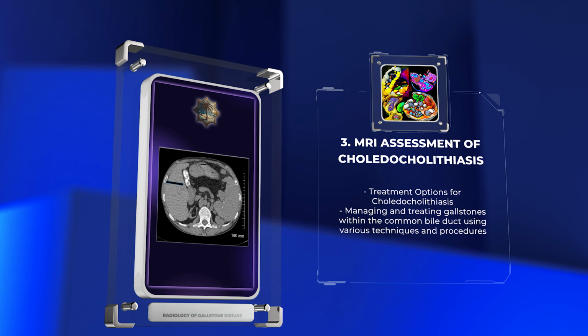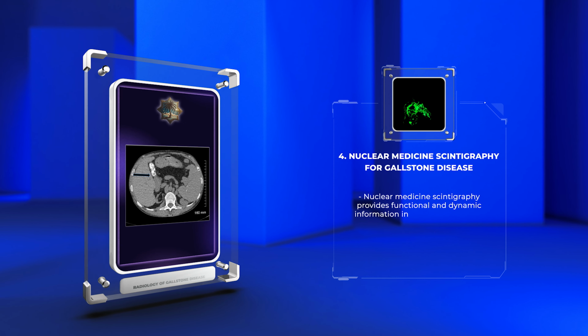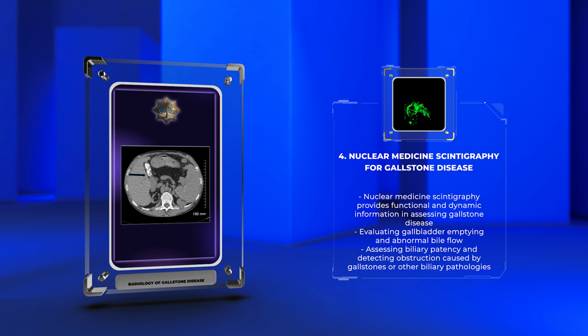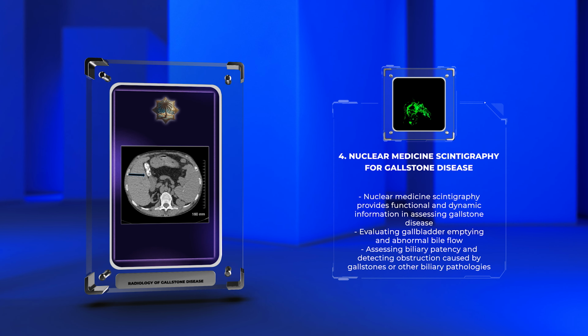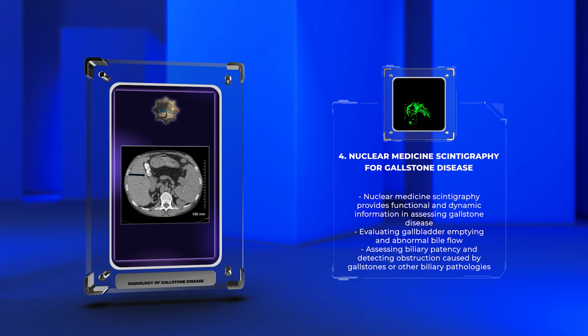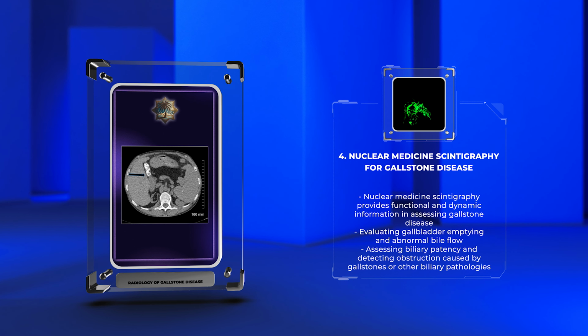various techniques and procedures. Professor, nuclear medicine scintigraphy, with the use of radiopharmaceuticals, provides functional and dynamic information in the assessment of gallstone disease. The professor points at a slide displaying a scintigraphy scan showing concentrated radiotracer in the gallbladder. Professor, by administering radiopharmaceutical agents, we can evaluate gallbladder emptying and the presence of abnormal bile flow.